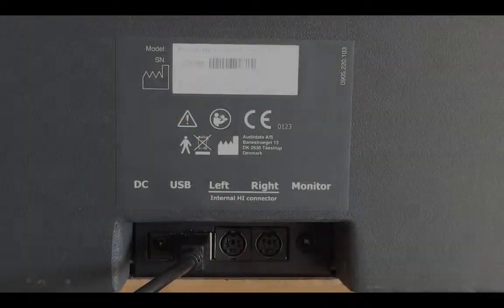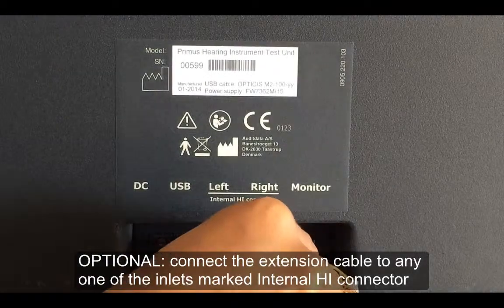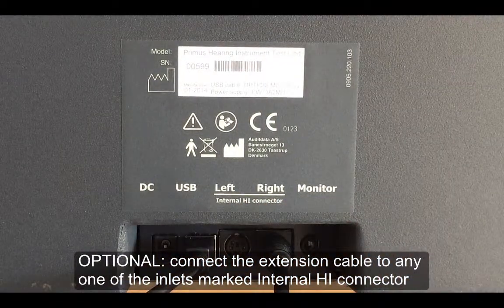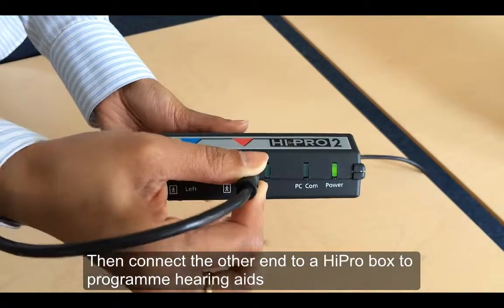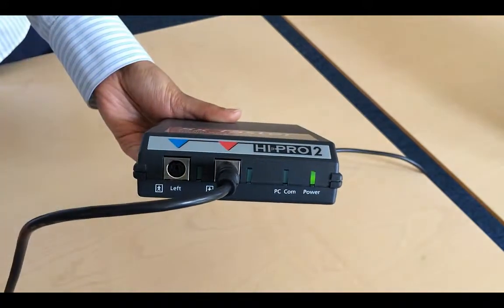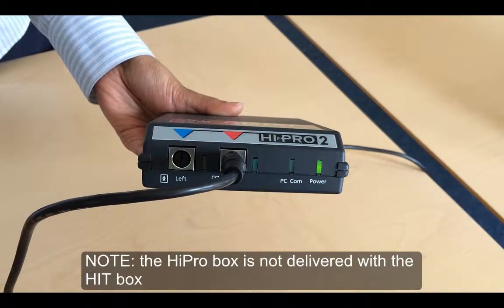One method to connect hearing aids to the test box is using the extension cables provided in the accessories bag. Connect the extension cable to any of the inlets marked internal HI connector. Connect the other end of the extension lead to the HI-PRO box to start programming the hearing aids. Alternatively, you can choose to connect the HI-PRO box directly from your operator computer. The HI-PRO box is purchased separately from your fitting unit.